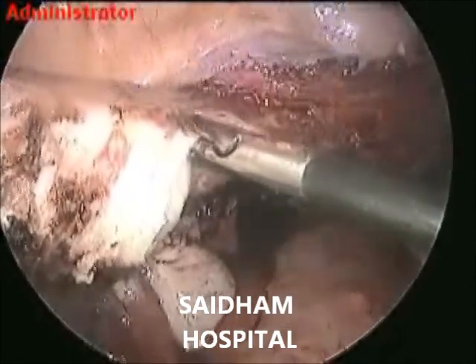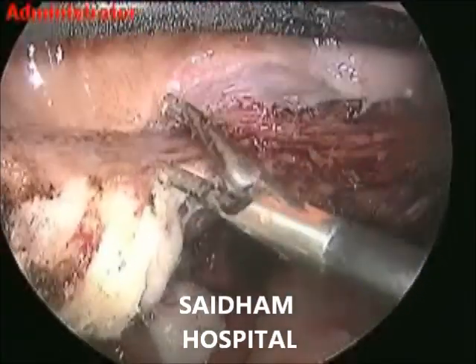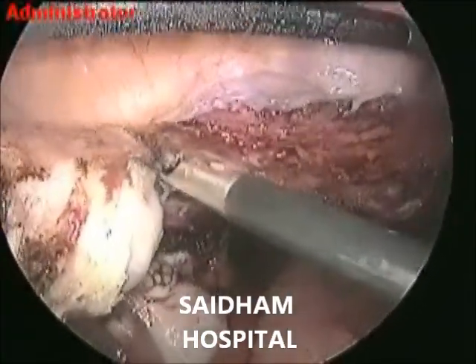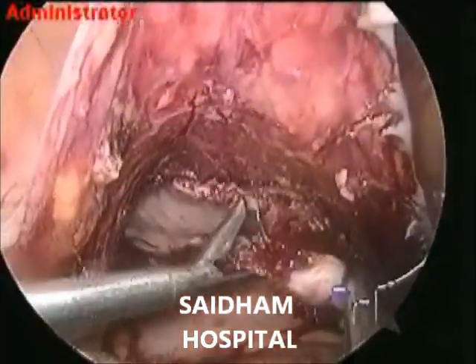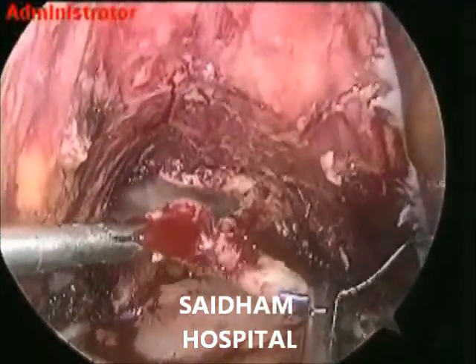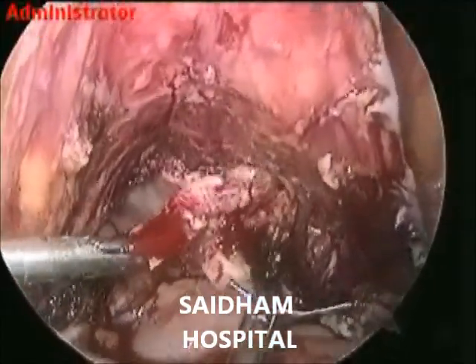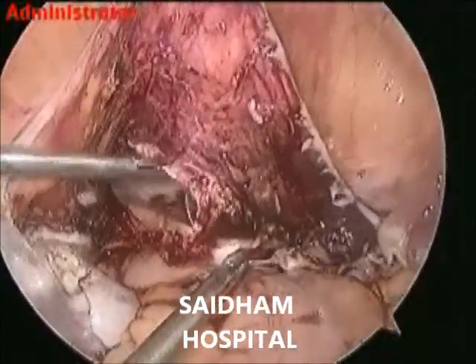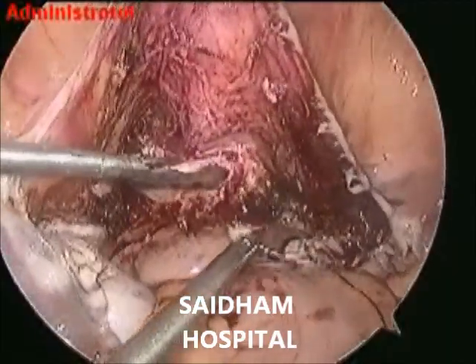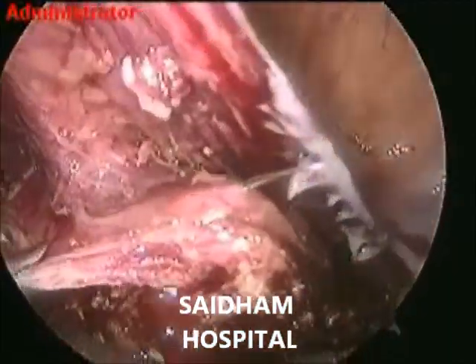There are different types of endometriosis: peritoneal endometriosis and ovarian endometriosis. Meticulous dissection is very important to expose the correct cleavage plane. If you want to preserve fertility, then preserving the ovarian hilum is very important.